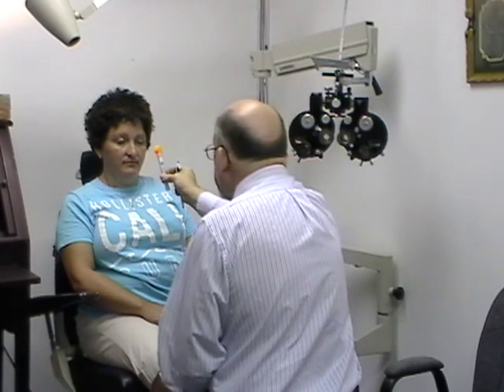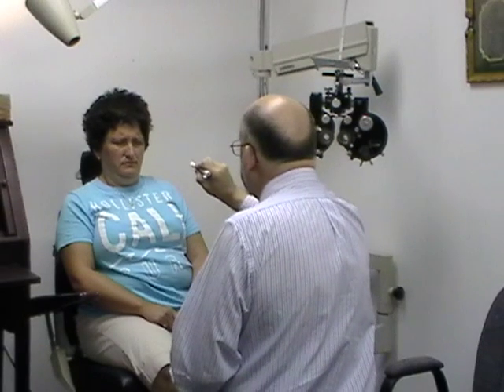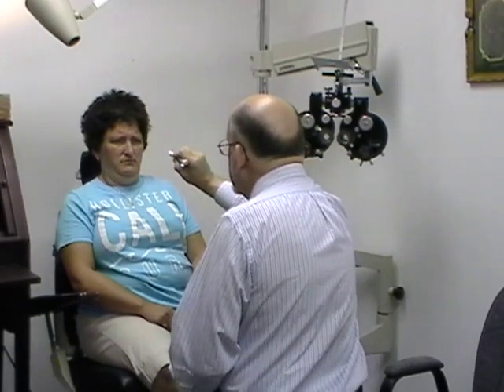We'll find out what happens with Fuego — it doesn't look too comfortable. Let's try it again, start coming in. We're getting a breakdown anywhere from 12 to 8 inches. We're going to use a bright target now; she had a lot of trouble with it before. Let's see with a bright target — we're getting trouble right here at about 12 to 14 inches.